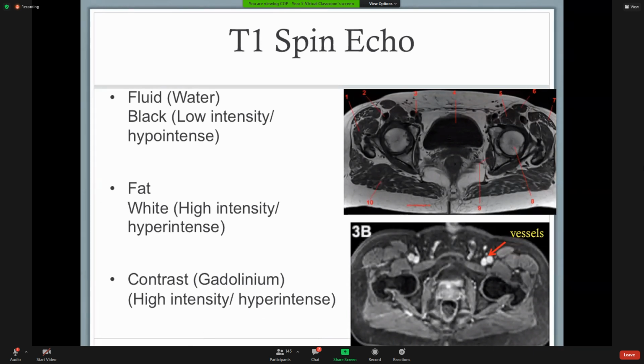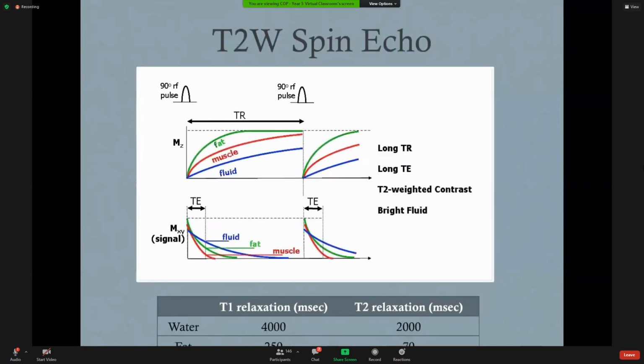So this is a better way to improve image quality, and it is also using one of the advantages of MRI in terms of being very selective and specifically focused on different tissues.